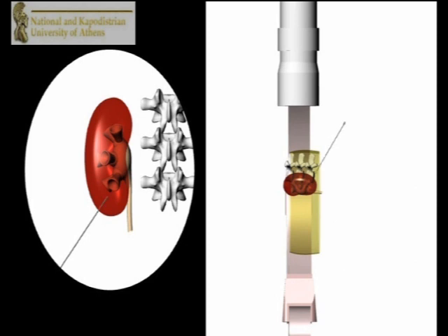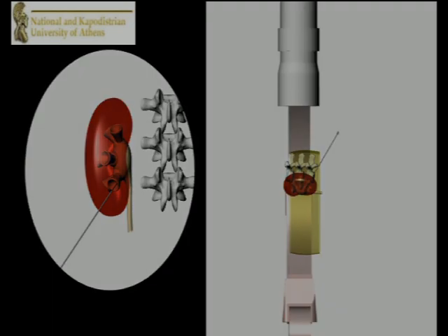We will demonstrate this technique in a horseshoe kidney. The first puncture in an upper pole calyx is performed by moving the C-arm in a cephalic direction, while a second puncture in a lower pole calyx by moving the C-arm in a caudal direction.